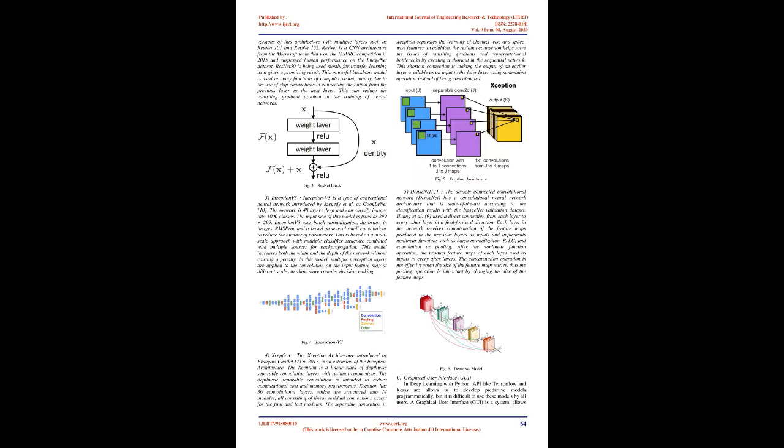B. Chest X-ray pneumonia 3. The chest X-ray pneumonia dataset has 5,863 X-ray images, in JPEG format, and 2 categories, pneumonia/normal. This dataset is publicly available on Kaggle; it was proposed for the Kaggle competition.